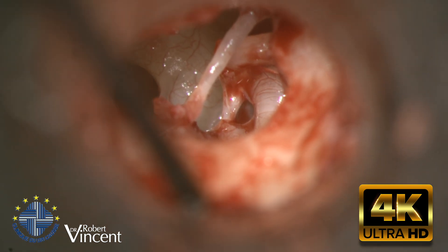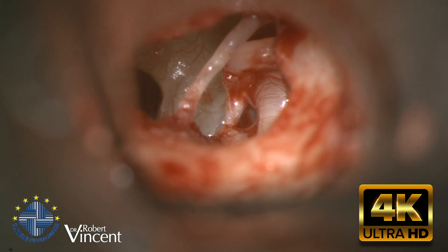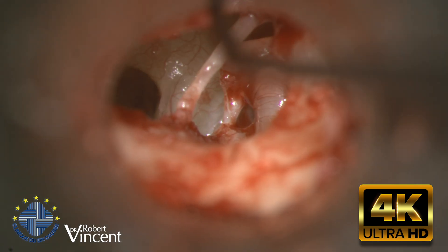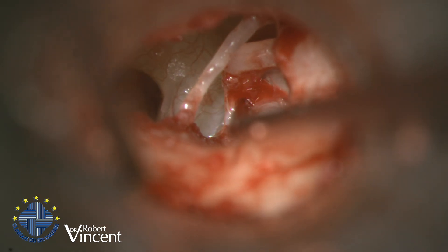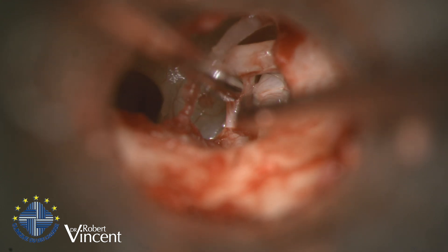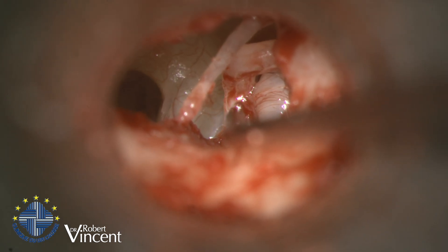This is a tricky case for a primary stapedotomy operation on the left ear. At 12 o'clock, 3 o'clock, 6, and 9, we can see a really dehiscent facial nerve. There is some fibrous tissue covering the facial nerve that I need to remove. You can see a complete connection between the facial nerve, which is completely dehiscent, and the stapes.